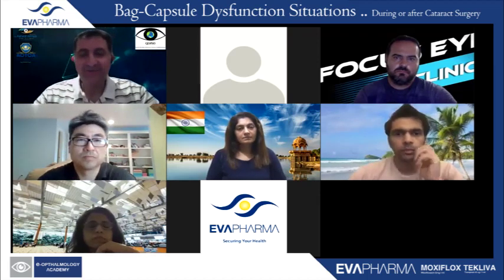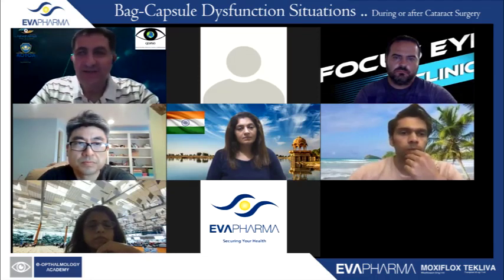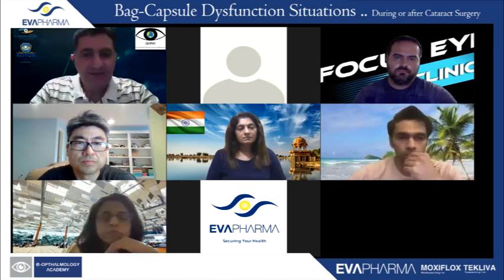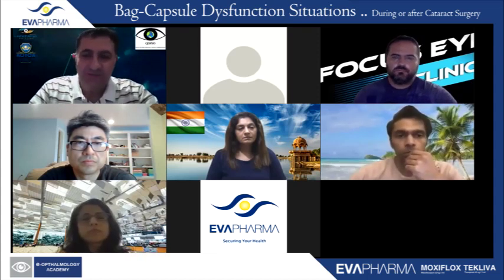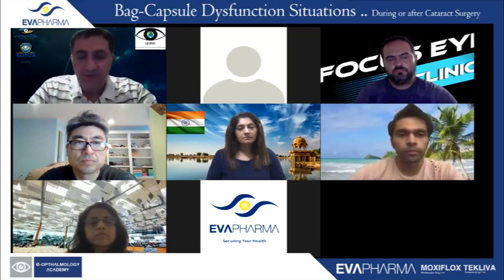I rarely remove the bag unless I feel that the situation is very difficult, the vitreous is coming, there is a posterior pressure, and I can't do anything. This is the only situation where I'm going to remove the bag, do a proper anterior vitrectomy, and choose either Yamani or a glued IOL.